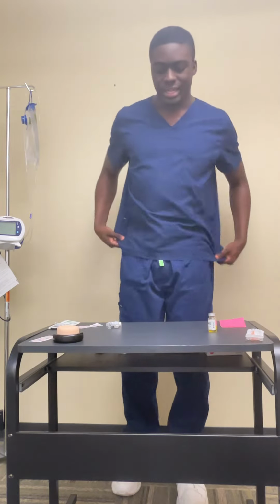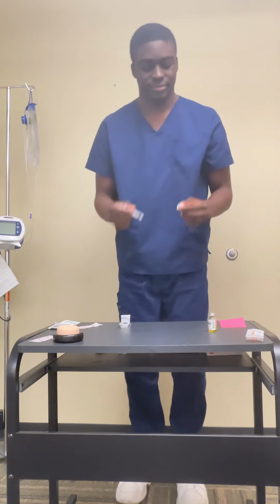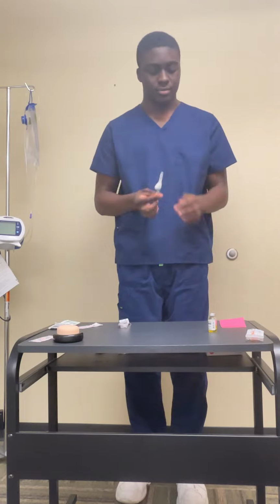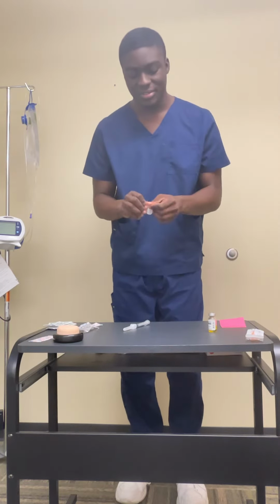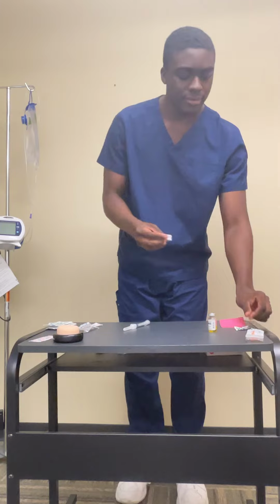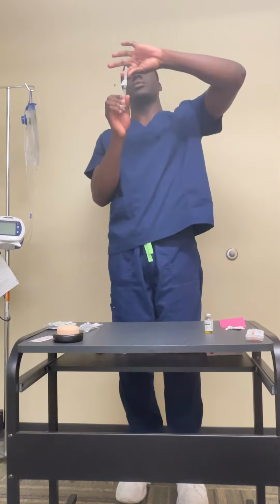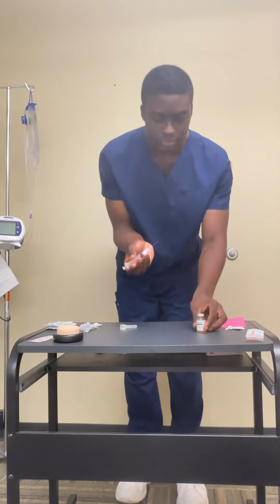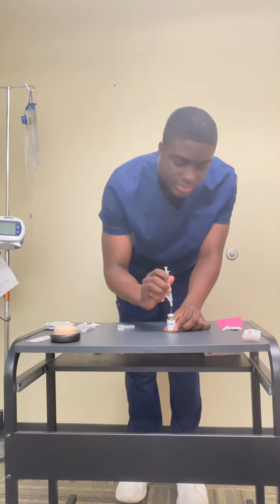All right, and now I will attach my syringe to my needle. And then I will get an alcohol prep pad. I will perform hand hygiene, and then I will engage my needle, get my alcohol prep pad, wipe off the vial, remove my cap, go in from level down, 45 to 90, insert.